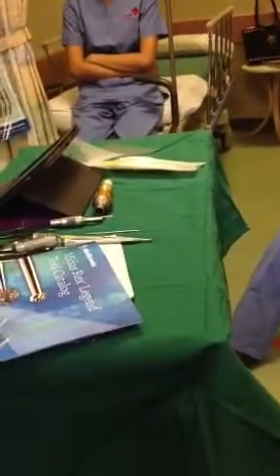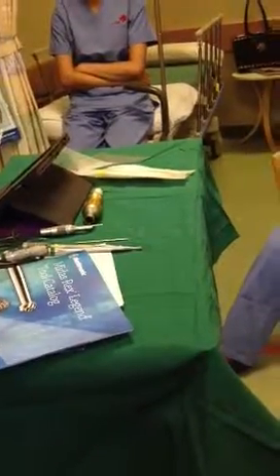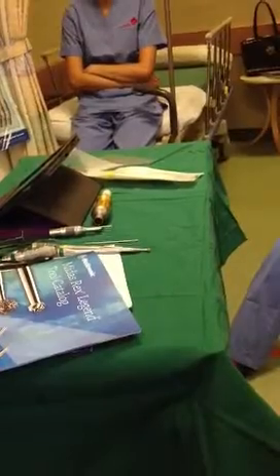I see. You see how? I don't know. One hospital, SGH, I don't know how they monitor. Let me check for you. They use about 20 times, and every time they replace after about 20 times. They will buy, not call. These are your own attachments. So 20 times.